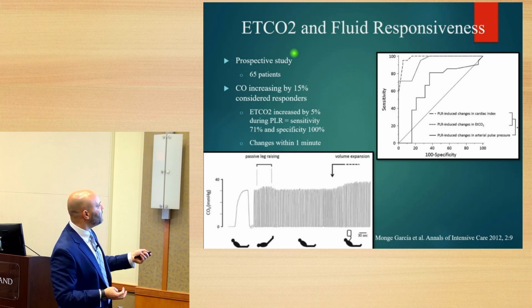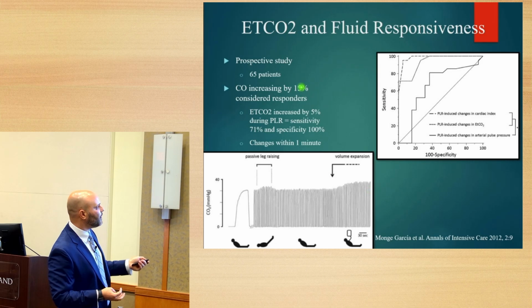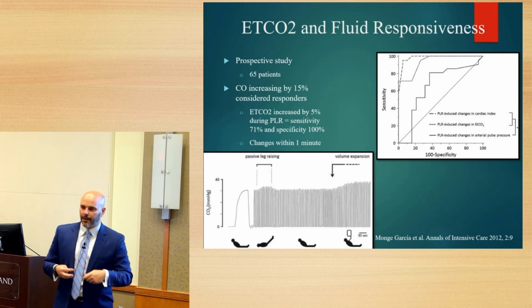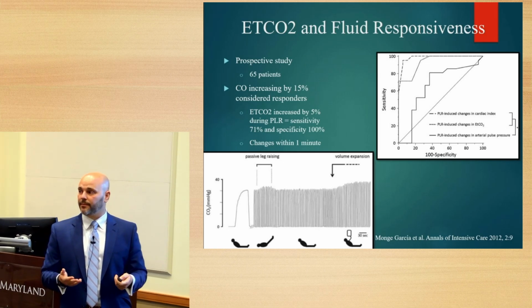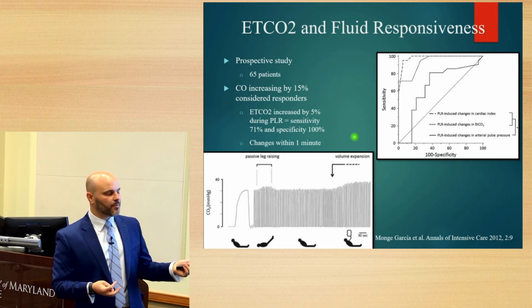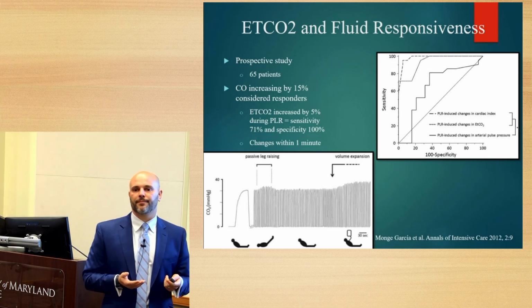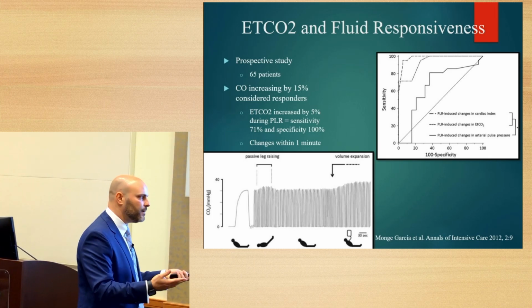So in those patients, they did a passive leg raise, saw if they were fluid responders, and then fluid challenged them and monitored their end tidal CO2. So if their end tidal CO2 increased by 5% during the passive leg raise, they were found to be 100% specific to be a positive fluid challenge and were receptive to volume.